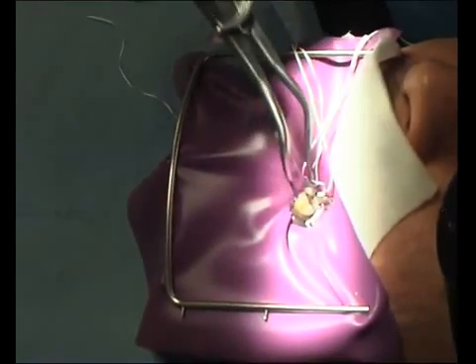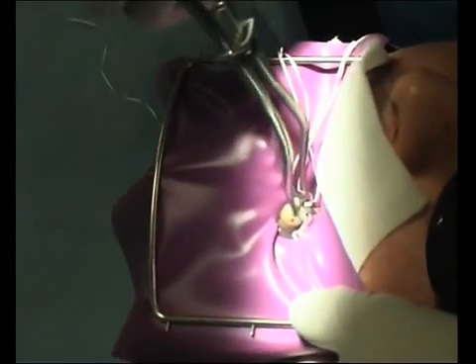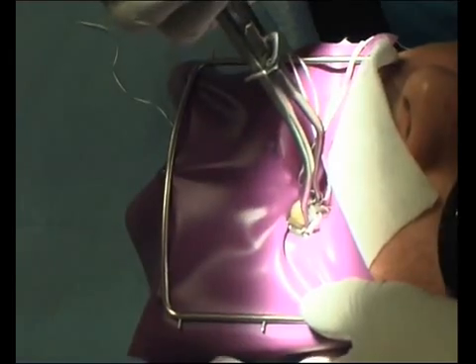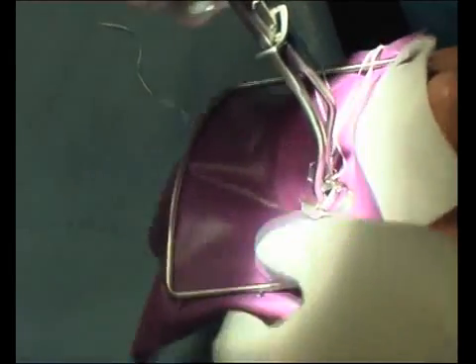Rubber dam off — take the rubber dam off, leave everything in place. Let's see what we've done before, because you can use a lower tooth to move the rubber dam down so you don't get the excess on the nose.